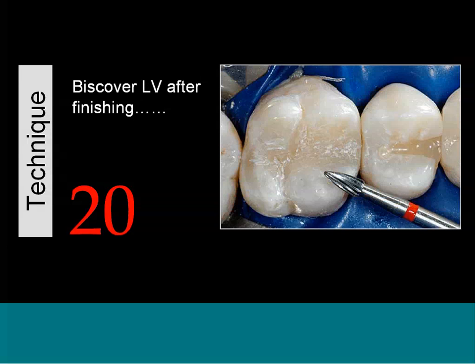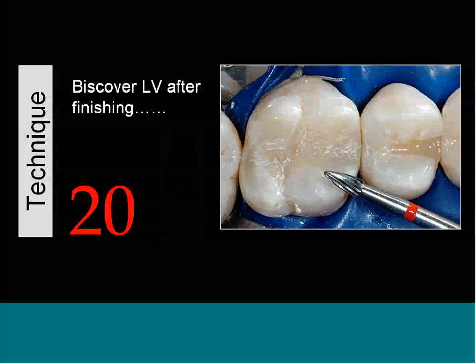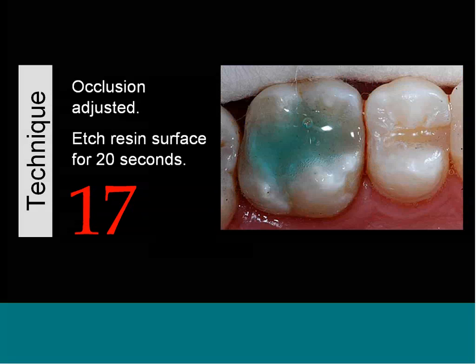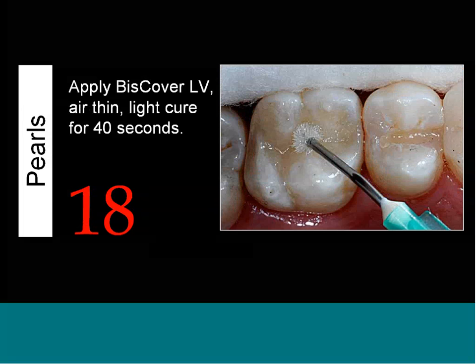So Biscover, I use that for finishing all my posterior restorations. So we're talking about posterior composites, but I use it for inlays and onlays. I use it in the anterior when we're finished with restorations. I use it for temporaries as well. So in this case, this is a class 2. I finished roughing and polishing it. Get the occlusion all adjusted, and then etch the resin for 20 seconds, rinse it off, apply the Biscover.